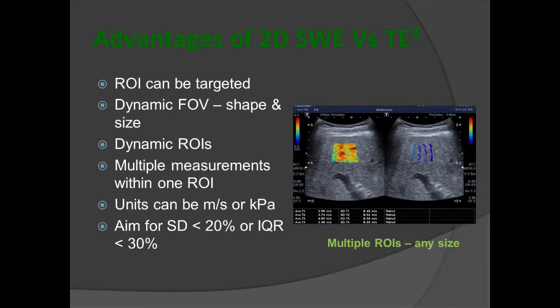Now, the ability to do a good ultrasound of the abdomen is not undermined in the literature. And the most recent WFUMB consensus was that even if you have never done elastography, if you've done more than 300 abdominal scans, you can do a good elastogram because you understand the anatomy of the liver, and therefore you will place the elastography sampling region of interest in the correct area.